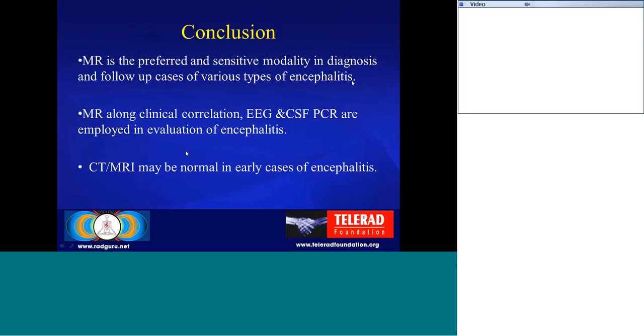of various types of encephalitis. But MR is not the only modality. MRI should always be used along with clinical correlation, EEG and CSF polymerase chain reaction, and CSF study for viral titers and viral antibodies, which are employed in the evaluation of encephalitis.